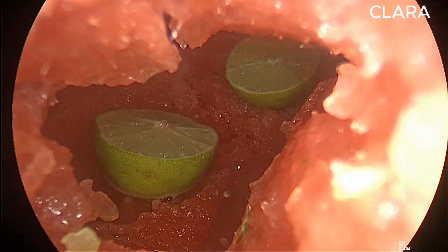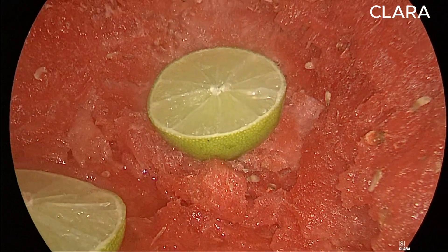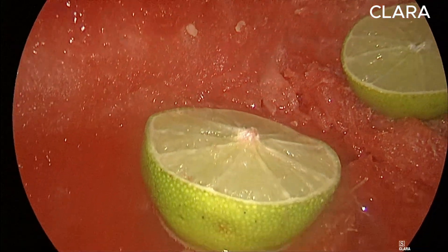Clara manipulates the image brightness to view dark spots better. With this mode, a specifically optimized algorithm reduces disruptive shadows and ensures more even brightness perception of the endoscopic image.